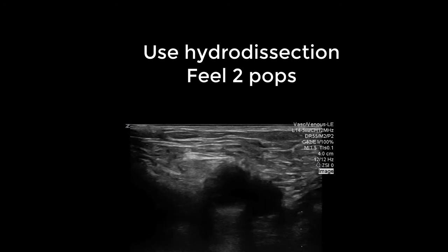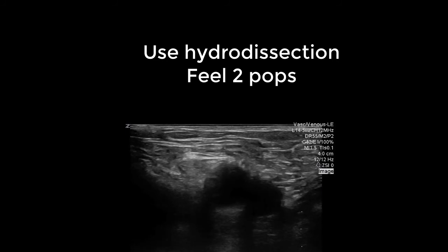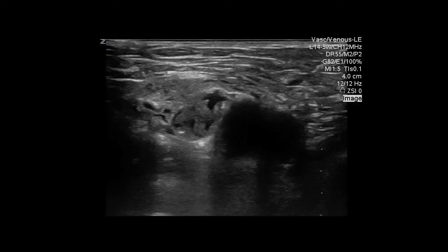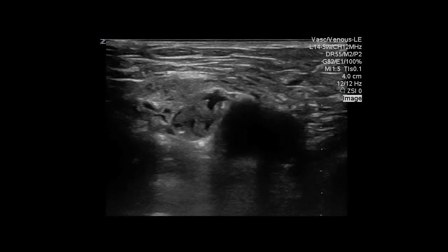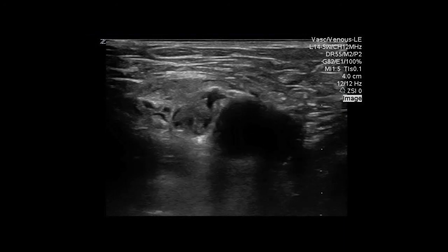You should see the tissues distend. By using the nerve block needle, you should also feel two pops — the first from the fascia lata followed by the fascia iliaca. Once you have felt two pops and you know the hydrodissection occurs lateral to the artery and there is no blood upon aspiration, inject the remaining volume of bupivacaine.